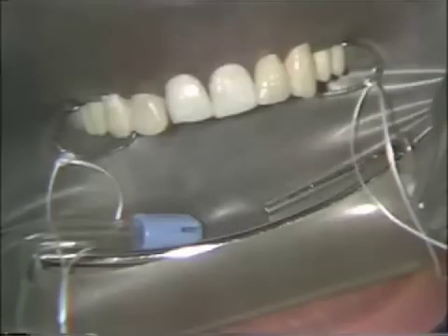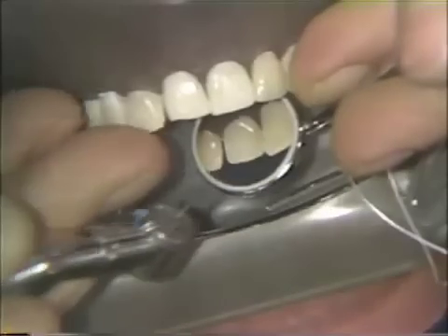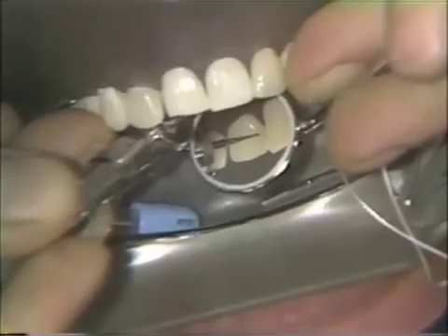After completion of the isolation of the tooth with rubber dam, saliva ejector, and so on, we will now be ready for our cavity preparation. This is a 1/2 round burr in the high-speed handpiece. You will notice the relationship of this 1/2 round in size to the carious lesion. As we point out here, this is the extent again of the carious lesion with the burr.